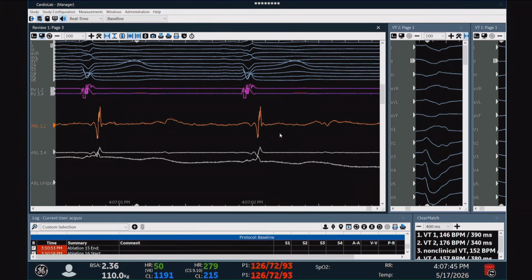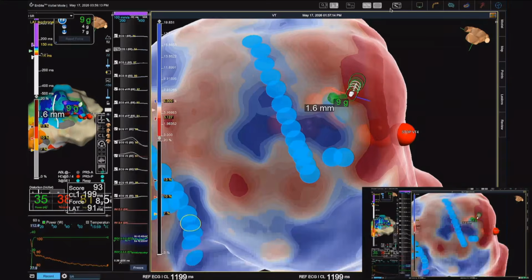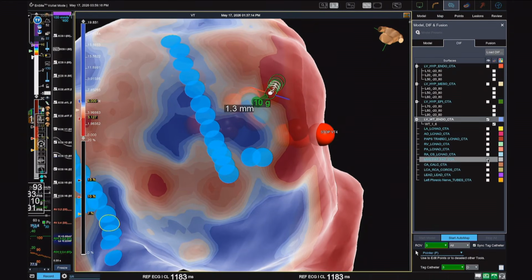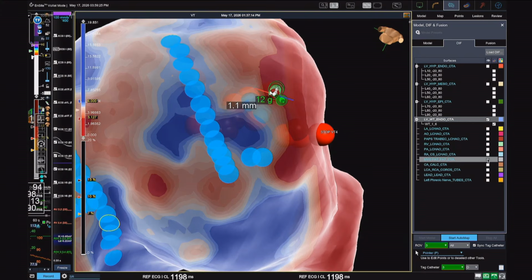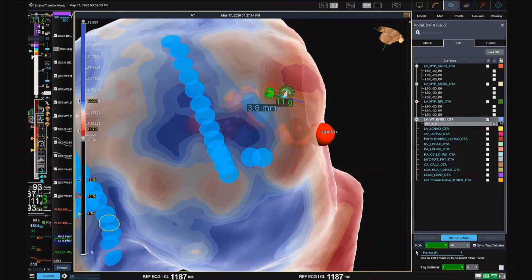Why are we extending the lesion until 60 seconds? Because the wall thinning here is more or less like 5. But if you put the fat here, put the fat, Maria, please. Go to the inside again, please. Can we see the inside for the audience? Okay, show the fat. You see, you have a lot of fat, so the transmission of radiofrequency here will not be very nice. So we'll move the catheter more. We'll try to join also to the mitral annulus because we don't want to do a perimitral block. That's the only line that I used to do in ischemic patients. Impedance, please, Maria.